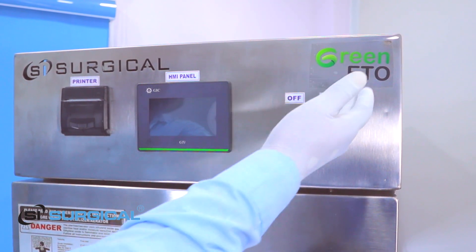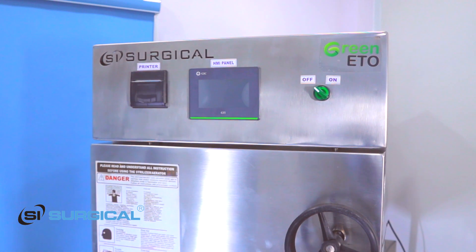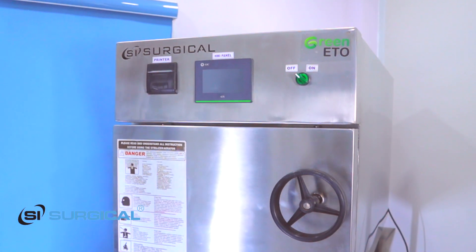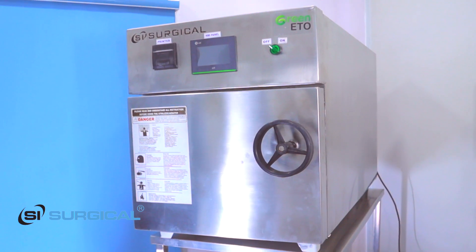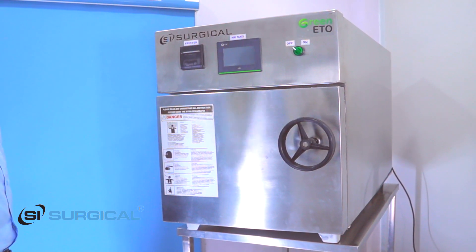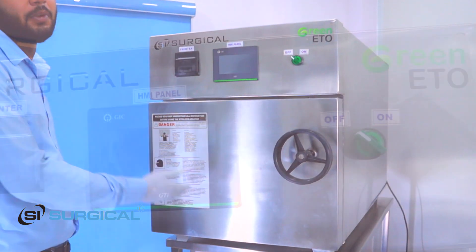We are going to introduce Green ETO made by SSRgical Private Limited. This is our 70 litre Ethylene Oxide sterilizer and I am going to demonstrate how to operate this ETO machine and what is the function of this ETO machine.